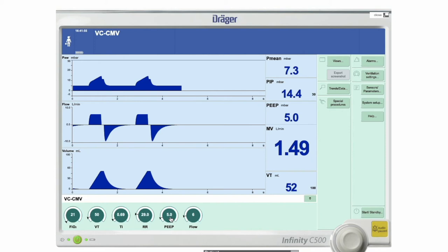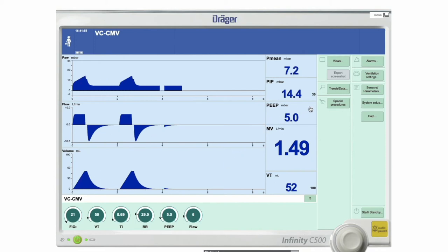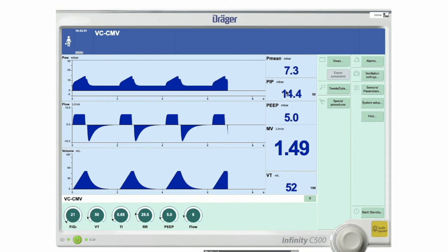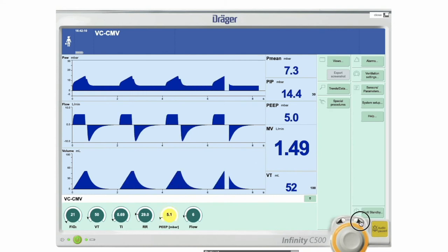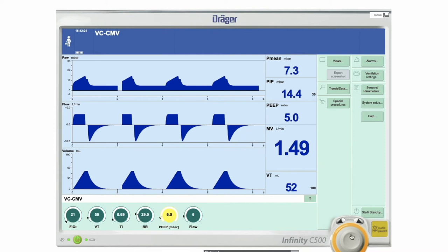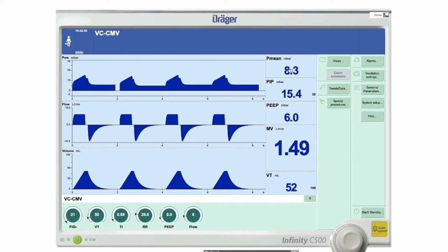When you increase PEEP in volume mode, PEEP, PIP, and mean airway pressure all go up, but the tidal volumes remain the same. Increasing PEEP to 6 confirms: PEEP goes up, PIP goes up, mean airway pressure goes up, but tidal volume and minute volume remain the same. However, if you get improvement in alveolar recruitment from that PEEP increase, tidal volumes and minute volume could actually go up over time — not immediately, but you might see improvement when you reassess 20-30 minutes later.